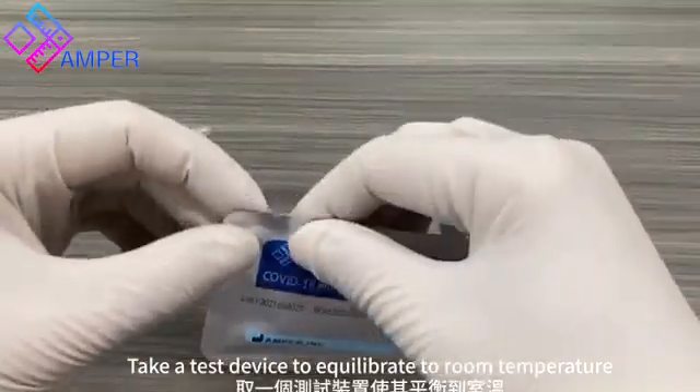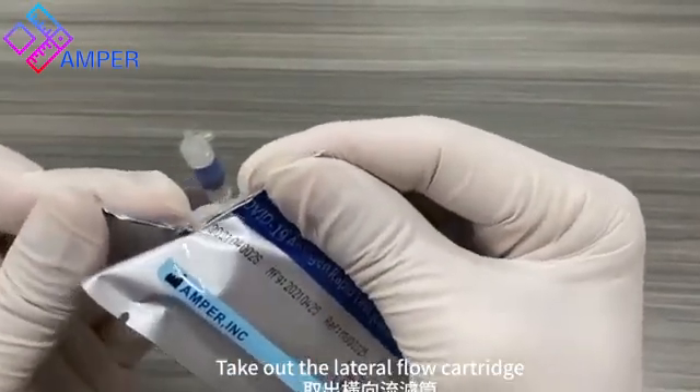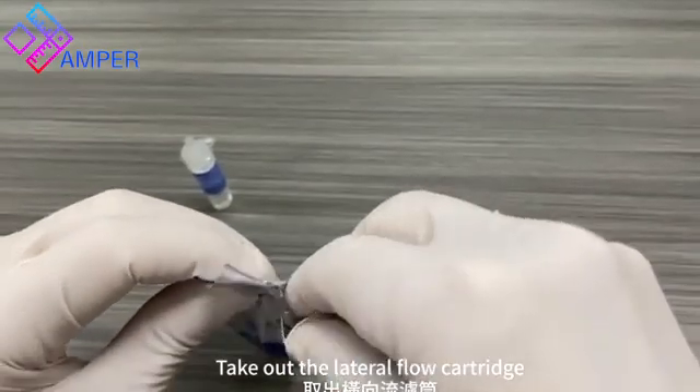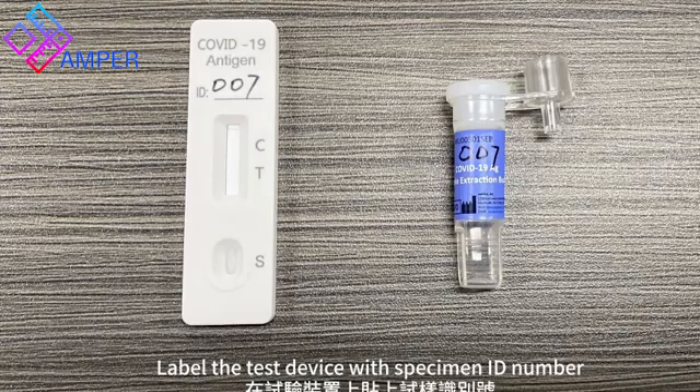Take a test device to equilibrate to room temperature and tear off the pouch. Take out the lateral flow cartridge. Place the test device horizontally on a clean workbench and label it with the specimen ID number.